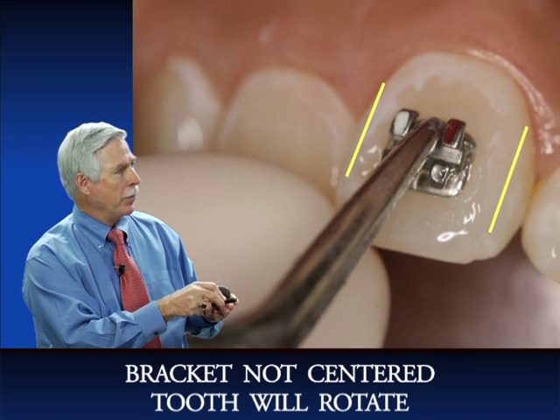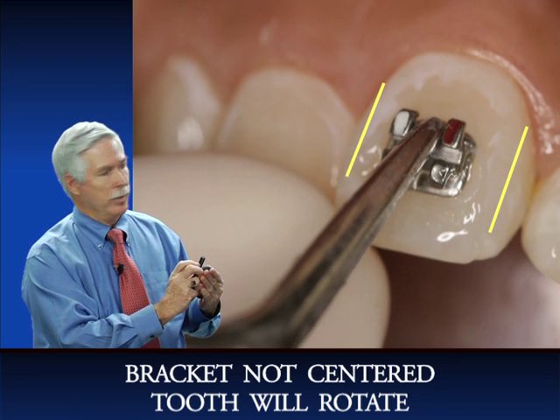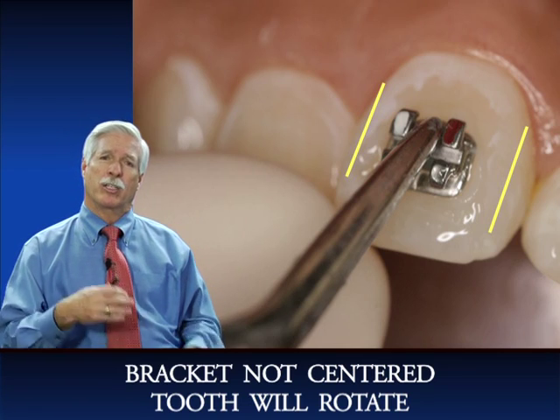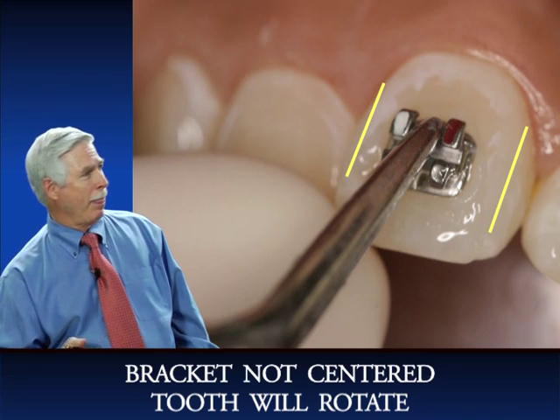So the distance from the distal part of the bracket to the edge of the tooth should be the same as from the mesial part of the bracket to the mesial edge of the tooth. Okay? So that has to be centered mesiodistally, as I mentioned, or you'll cause a rotation of the tooth. So that's cardinal rule number 3.